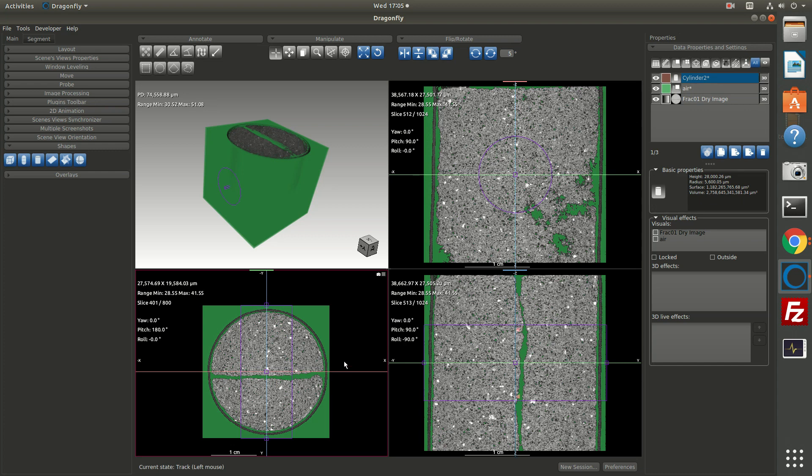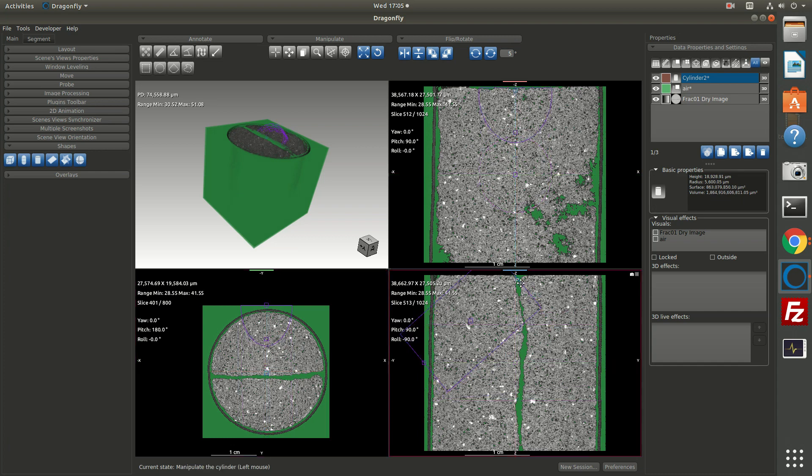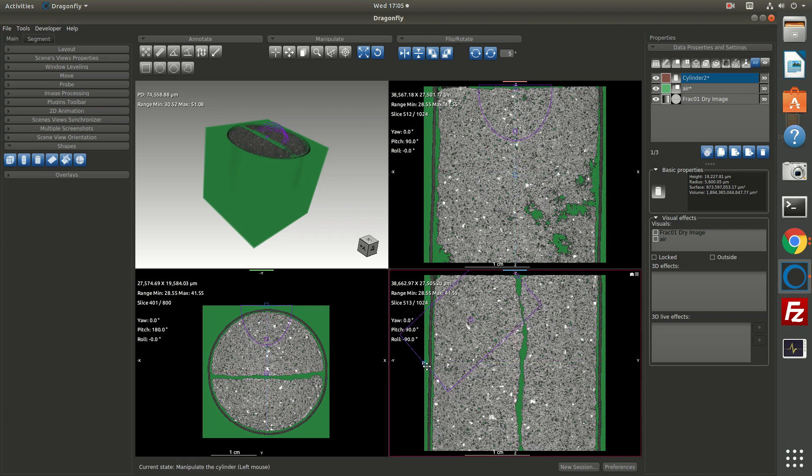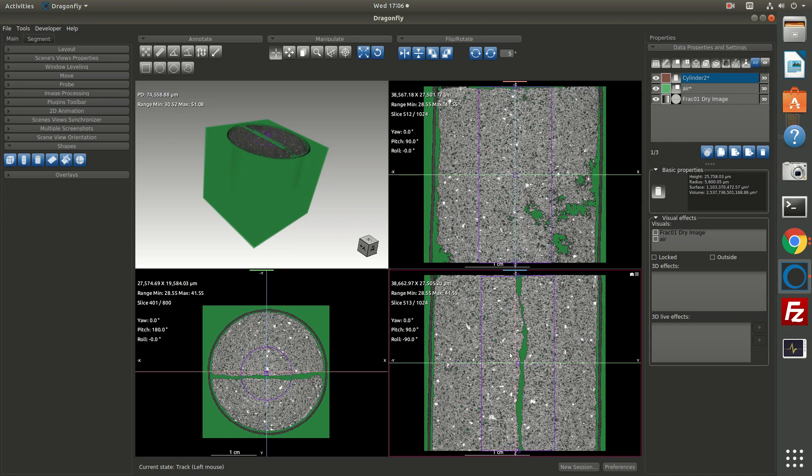Now it's not lined up with my sample, but you can rotate or change the height or change the diameter of your cylinders quite easily. In this case, I'm going to grab the box right here and drag it to the top middle of the image and grab this one and drag it to the bottom middle of the image. And now I have it aligned with my sample.